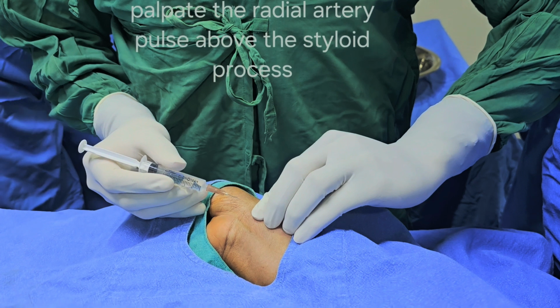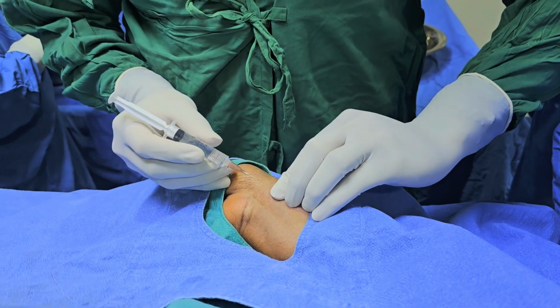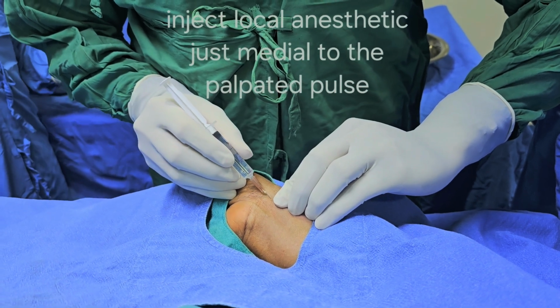Take your time palpating the radial artery. Notice if it is sclerotic. You can roll the artery underneath your fingers to feel for it. Once you localize the artery, inject the local anesthetic just medial to the palpated pulse.